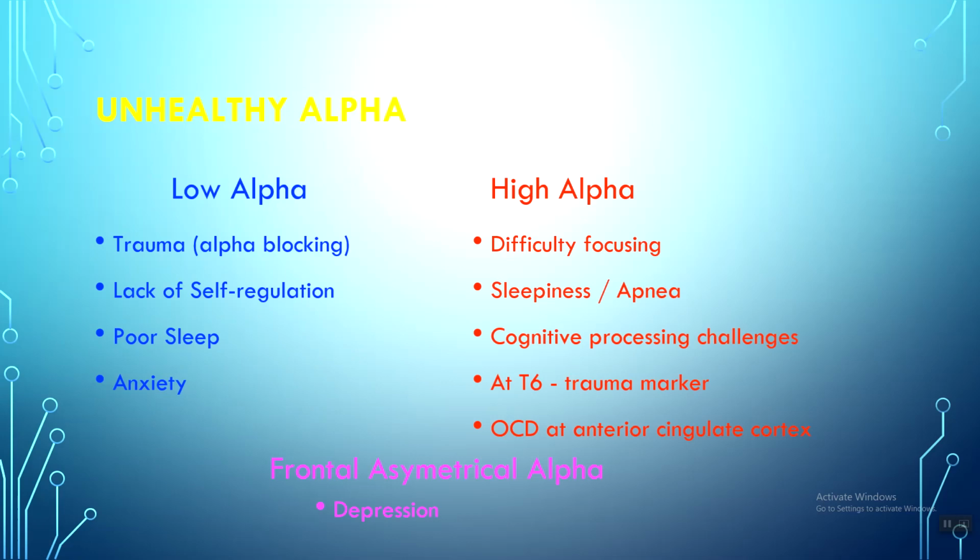So in cases of soldiers or people that have been exposed to really traumatic things, it's one of the forms of dissociation. Okay? So in a very neutral sense, temporal lobe alpha, be it left or right, and the temporals are these big chunky things on the side, is a form of frontal lobe disengagement. I'm not hanging out, right? Because alpha is an internal orientation. I'm not going to pull any external stimuli. T6, that is the marker of traumatic experience, and so gating is that alpha.